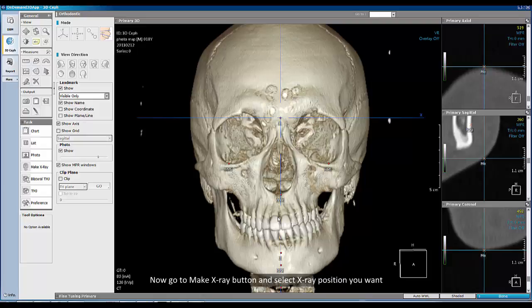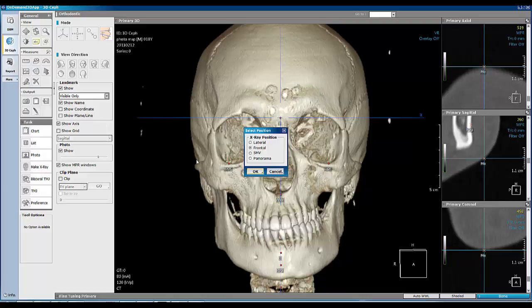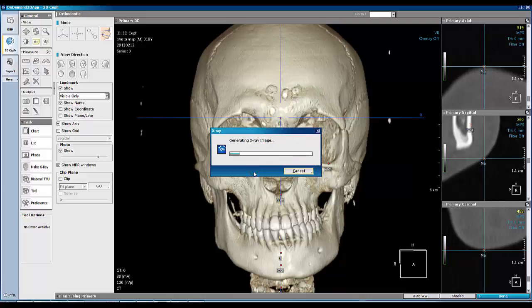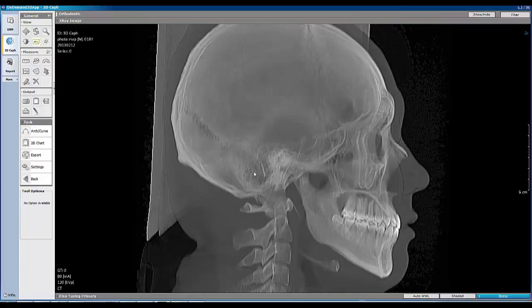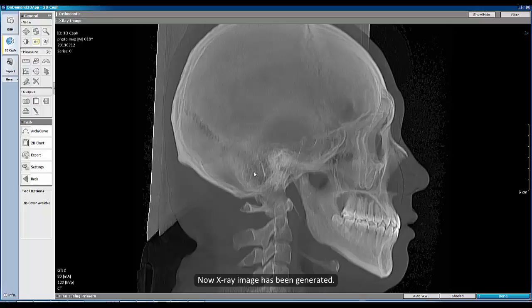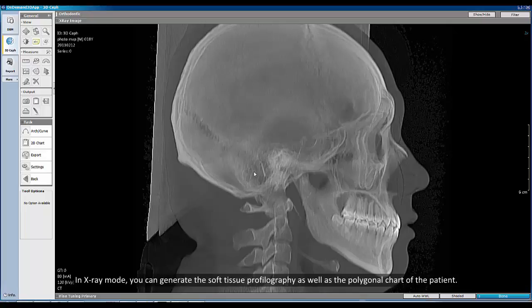Now go to the make x-ray button and select the x-ray position you want, and click OK. The x-ray image has now been generated.